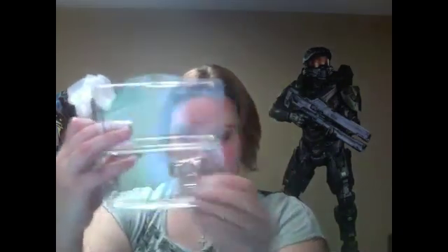So it's pretty cool. Now, I'm going to opt out of spitting in front of you, but I'm going to fill this up, close the cap, and then once you get your sample with the liquid in it, there is another cap in here. Where's my, oh, there it is. I didn't see it. It's in this little thing. It's right here. You put this little cap onto it, and then you shake it up pretty good. I think it says for 30 seconds. And then you place this with the cap into the biohazard bag.